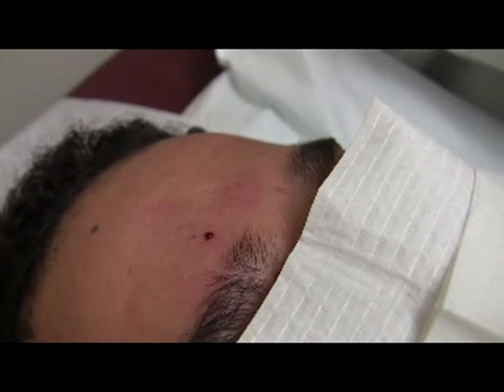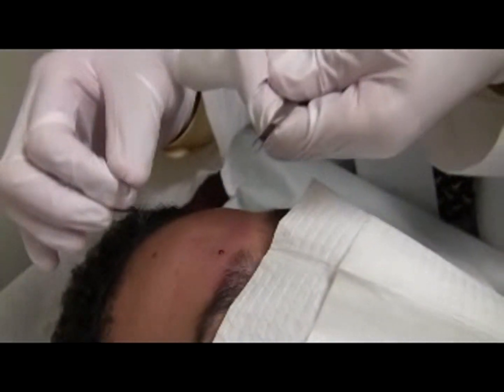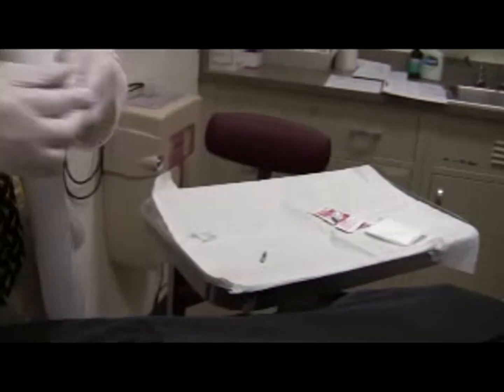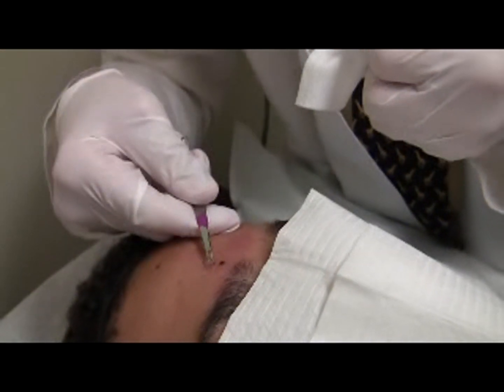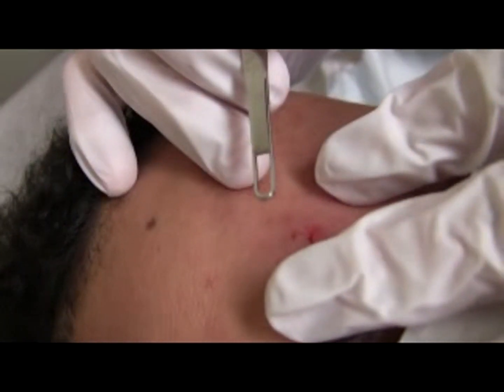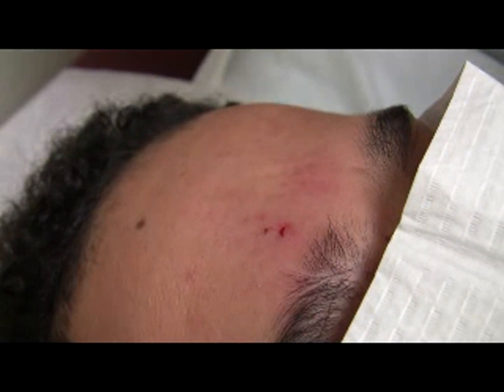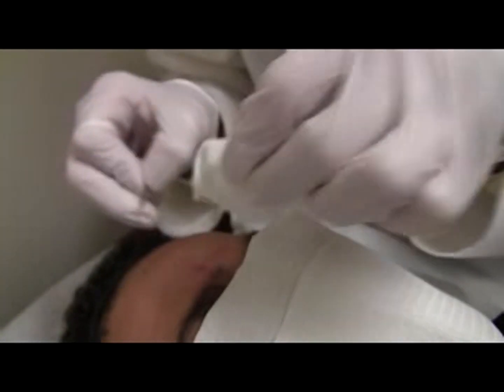At this point, bleeding may occur. Notice that I'm not going to hold the two instruments at the same time — I'm going to put down my 11 blade on the tray. Do not blot while holding the 11 blade, as your attention will shift away from the blade position and only to stopping the bleeding. If I'm holding this and I blot, I can stab myself. So I put this down and then I blot.